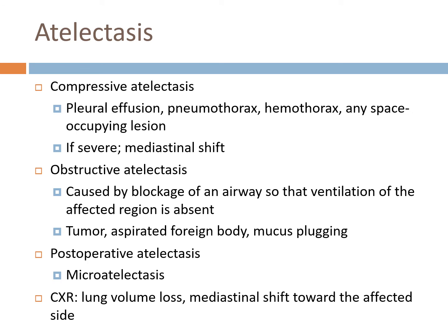So on your chest x-ray, you have a mediastinal shift toward the affected area. I've got to think about that for a minute. Hold on. Okay, on further investigation here, so I guess they're talking about a fairly large amount of atelectasis, so it's not so much the compression part, but if you have a lobe that has collapsed, then your shift of the mediastinum is going to go towards the affected side because it's going to try to take up that empty space.